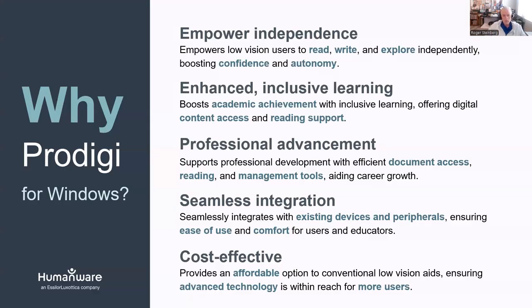through voice of customer, we learned that people already were using a lot of Windows devices, and if we could allow them to continue to use those devices seamlessly in school, work, or their personal life, that would be really helpful to them and make it easy for them to transition to a tool like Prodigi for Windows. So we looked to develop it to be seamless with those. And then we wanted it to be cost effective.